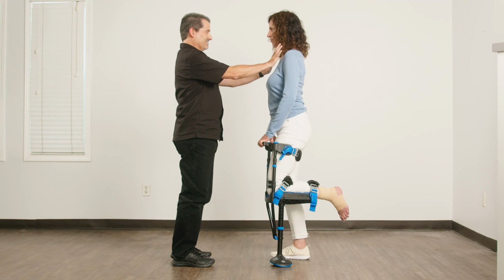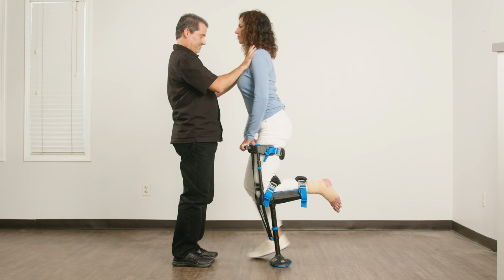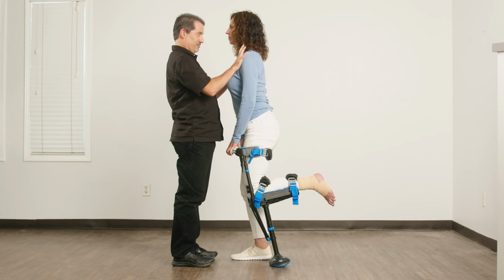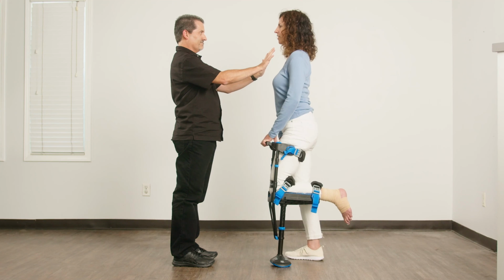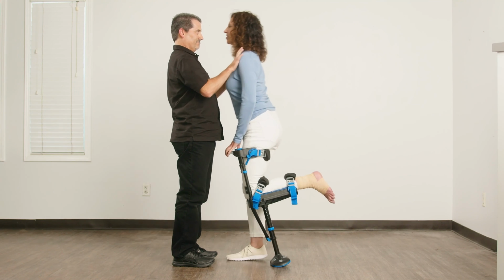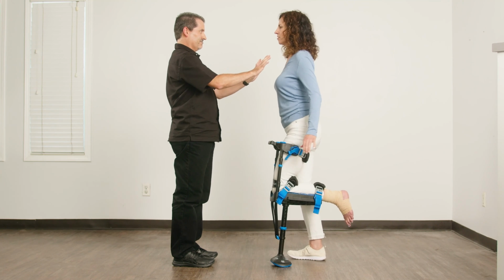If your patient does this, place your hand in front of their upper chest and instruct them to bring their upper body all the way to your hand before they initiate a step. When they do this, they will naturally step forward with their good foot. Repeat this exercise as many times as it takes in order for the patient to step fluidly.